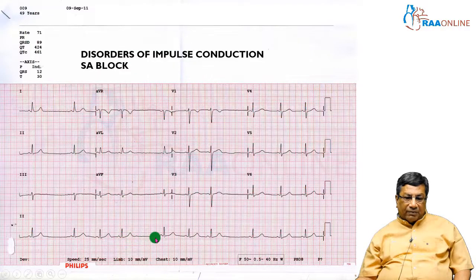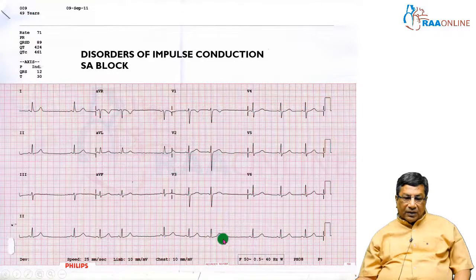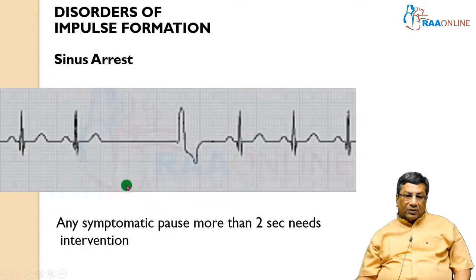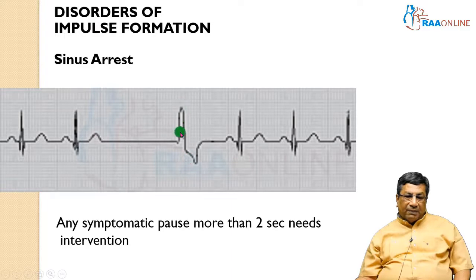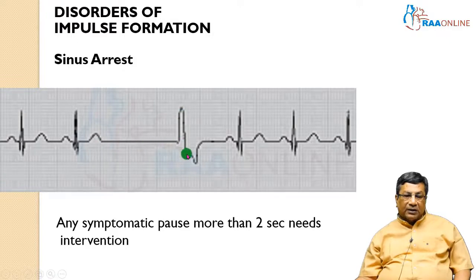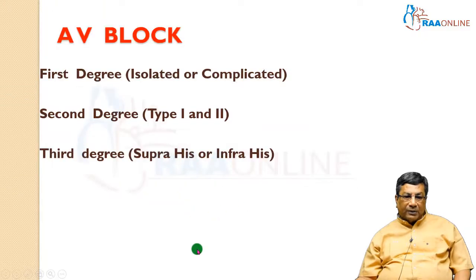You can see the pause here, and inside the pause you don't have any P waves, so this is likely to be a sinus pause. The sinus pause can be terminated by an escape beat — this escape beat comes as a savior. If an abnormal beat comes after a pause, it is likely to be the escape beat saving the patient from sinus arrest. Any symptomatic sinus pause of more than two seconds may need a pacemaker.